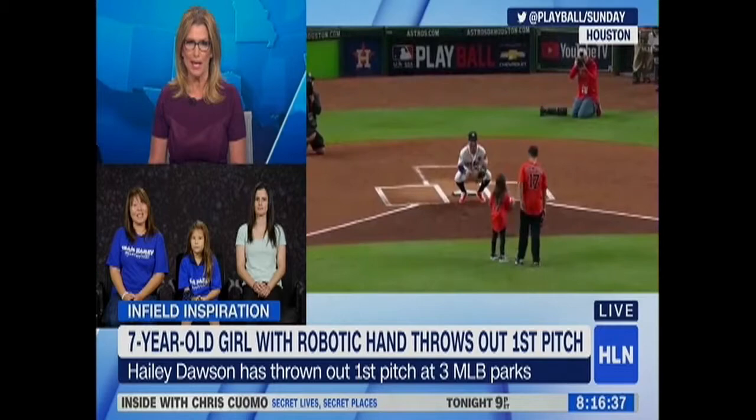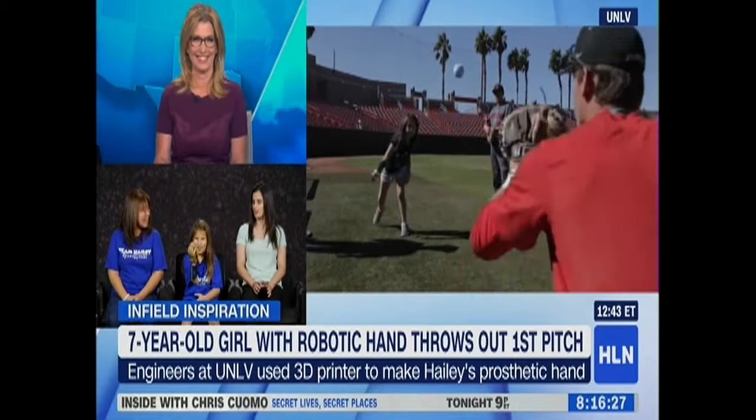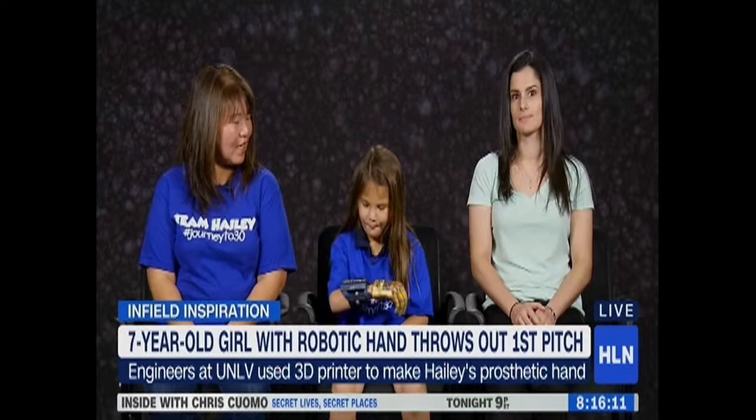Maria, explain to us about Haley's bionic hand — and Haley, if you feel comfortable, can you show us while Maria is explaining? We 3D printed all the parts for the hand. It works by tension in the fishing line — when she bends her wrist, the fingers close. It's all 3D printed and then we paint it to match whatever event she's doing.